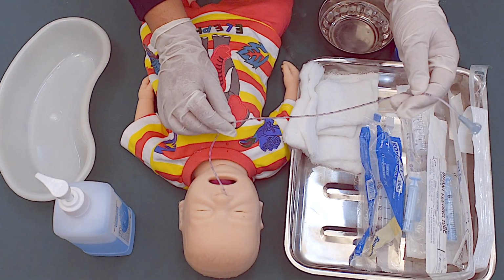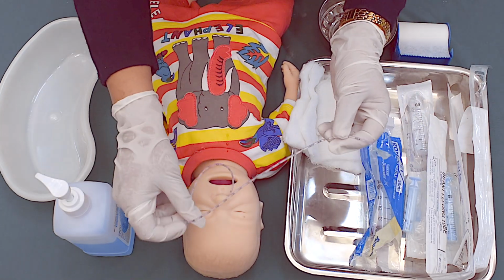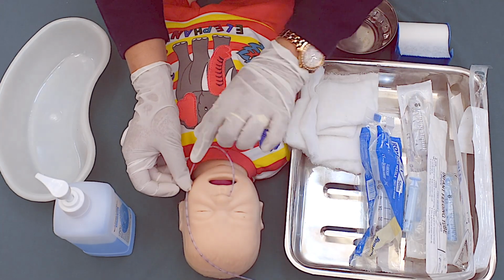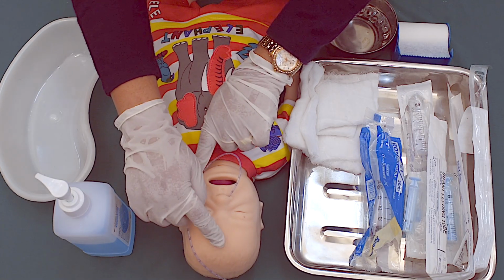Once the placement of the tube is ensured, it is to be fixed either to the side of the cheek or on the forehead.